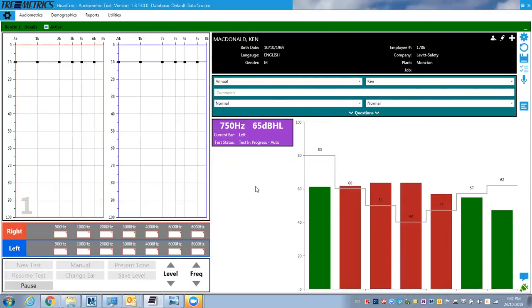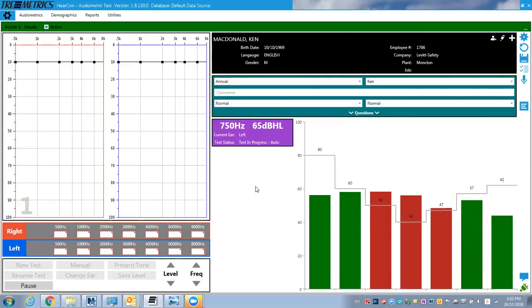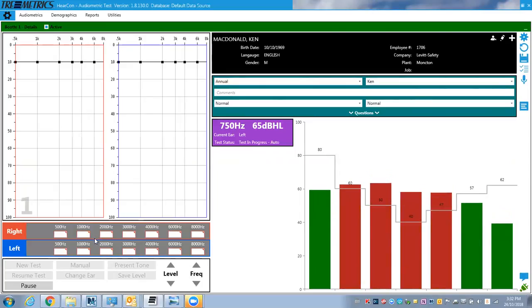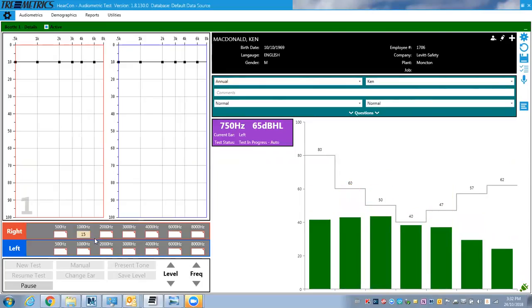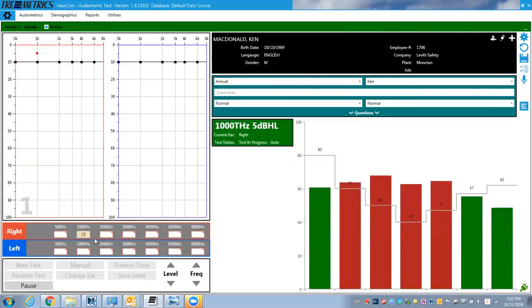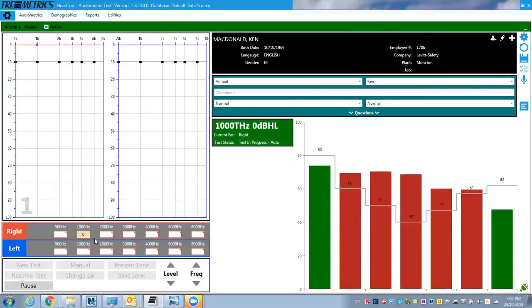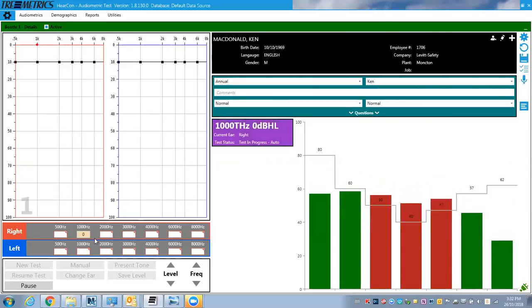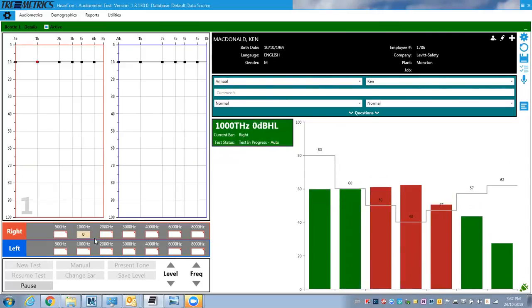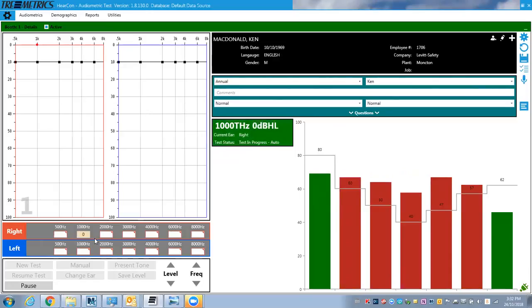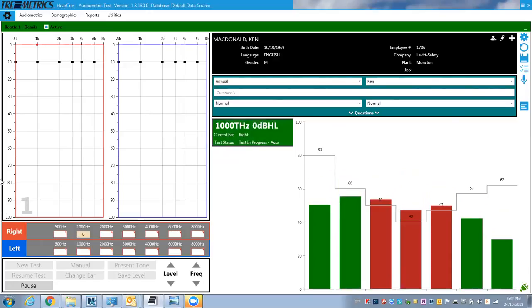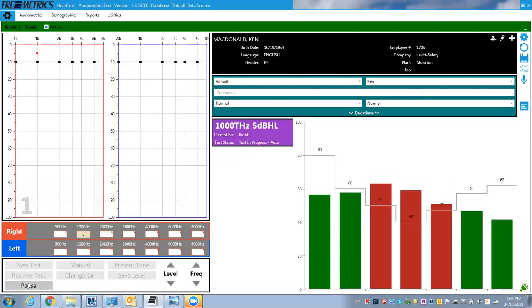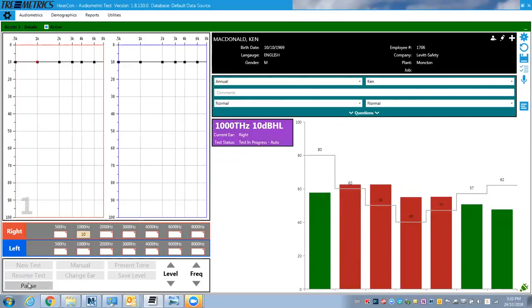So now it's turning green, so the test is running. It's actually reading the instructions to me through the headphones and it'll start to present tones automatically. So if I start responding, it'll also give me instructions if I'm hitting the button too many times or too quickly. It'll actually come on and tell me that I'm not doing it correctly. So it'll automatically go through and it'll generate all the values here for the right and left here. So I'll just pause that because it'll take a while to go through.